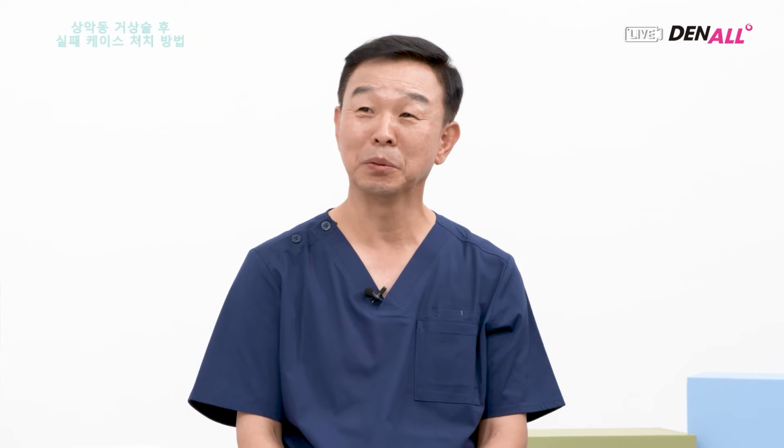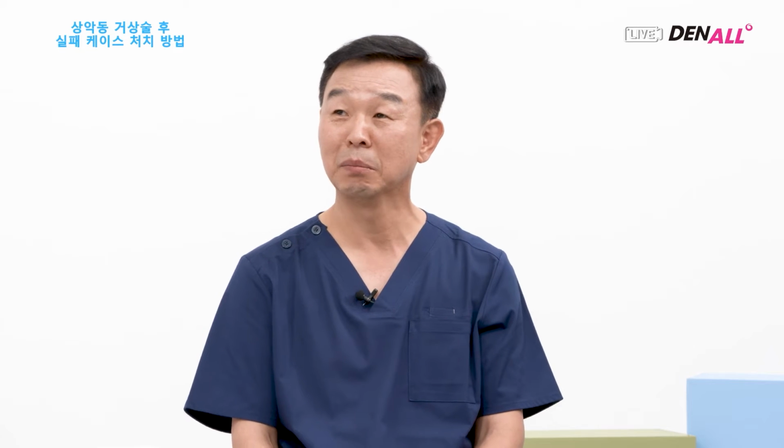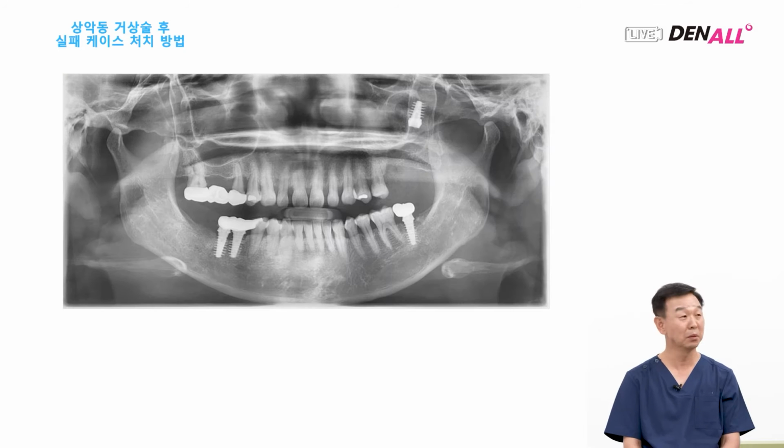How can you remove that fixture? There are broadly two ways to remove the fixture. The most frequent approach would be through the external wall of the sinus. The second approach is used a lot in otorhinolaryngology using an endoscope. Mostly, the lateral window approach can be used to remove it.